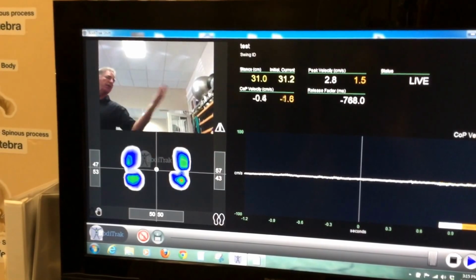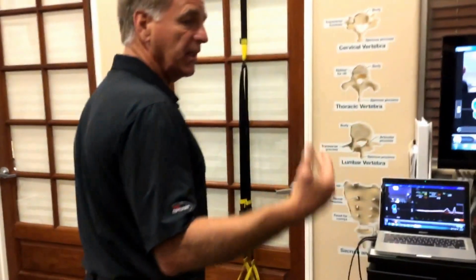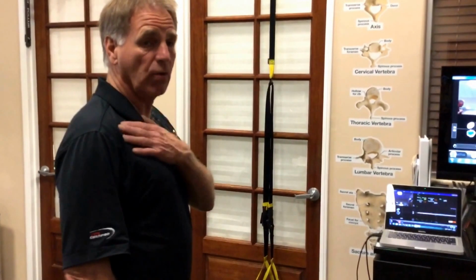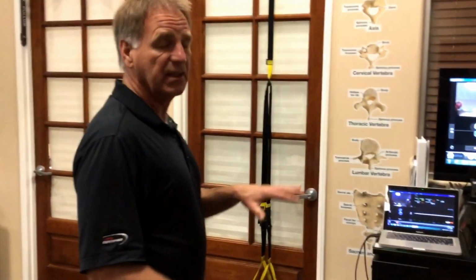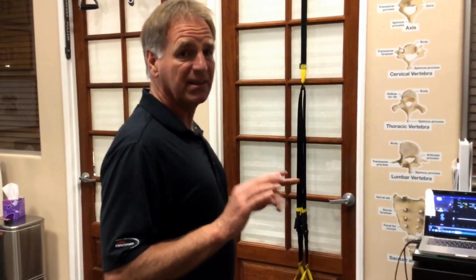So if we look at that individual who's presenting with a big side-to-side deficit, the most common one we'll see is in a right-handed person, who tend to see 40-60, or at least a predominance on the right COP. And that has to do with different things like muscle mass on the right-hand side. Don't get COP confused with center of mass. That's a complex issue. Maybe talk a little bit about it.